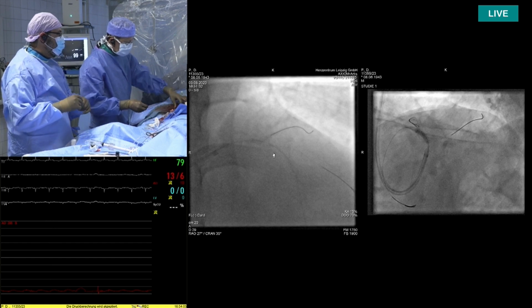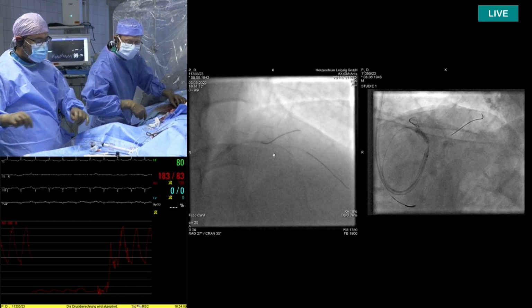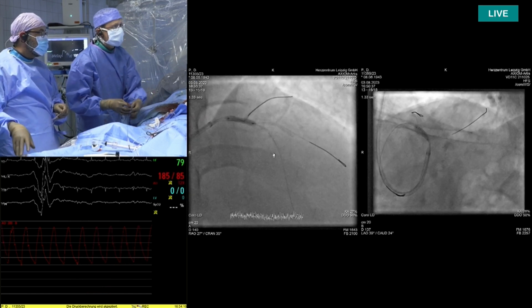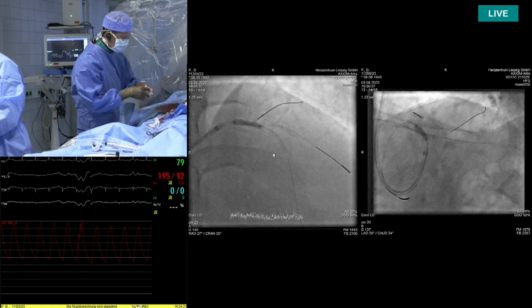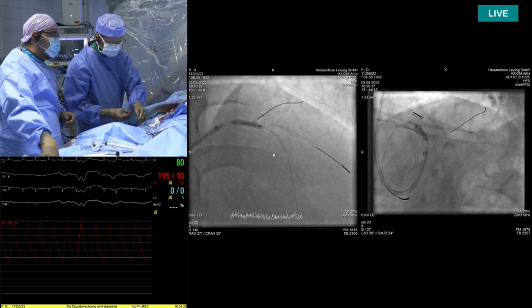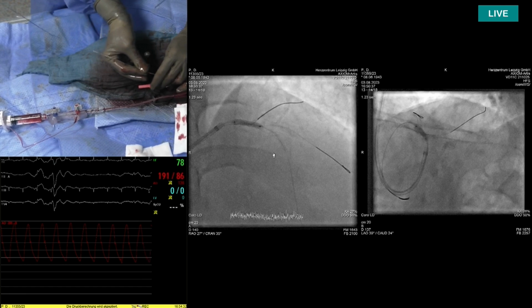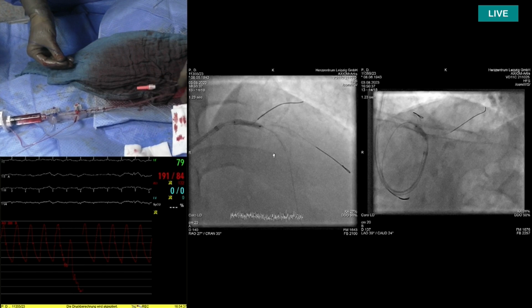So we still see some under expansion of the balloon in the distal left main. Let's assume that you do imaging now and you see that there is still suboptimal preparation there. What is your plan B for continuous plaque modification? Since you now increase the lumen with balloons, atherectomy now will be more limited in its effect. Yes. So there is maybe a minor under expansion of the balloon. If this was a massive under expansion, I would have taken a larger burr. I would have taken a 2.0 burr.